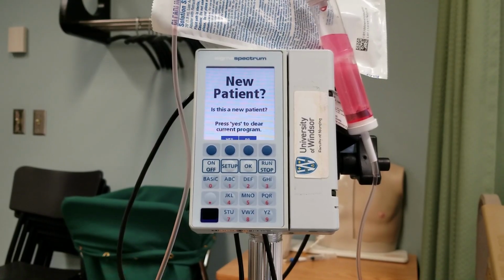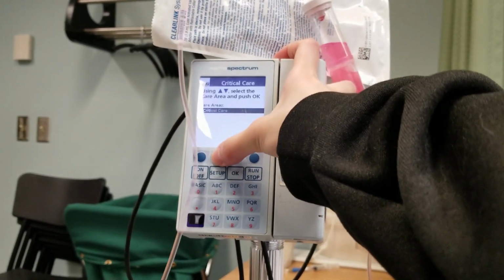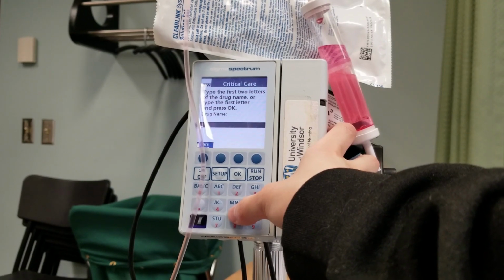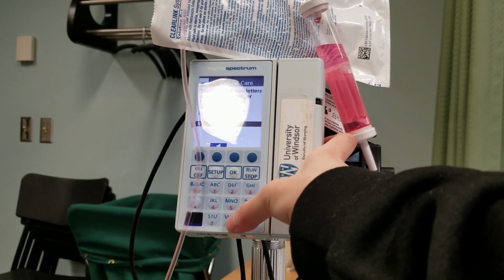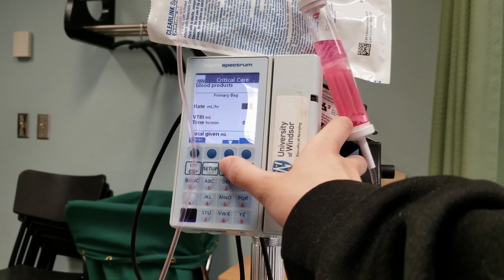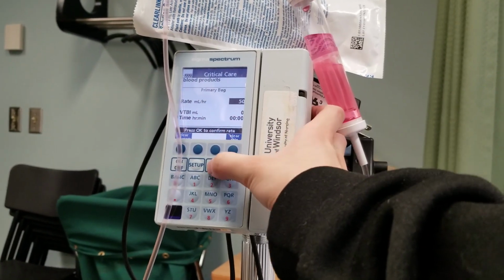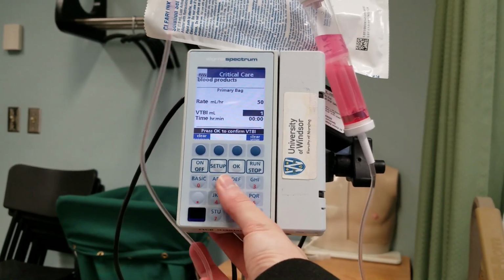Perfect. So I'm going to go ahead and program my pump. So yes to a new patient. And then for any of our blood products, we put just blood products. Doesn't matter if it's packed red blood cells, albumin, etc. And then for our first 15 minutes, we're going to put our rate of 50 and our VTBI, which as we discussed earlier is 12.5.